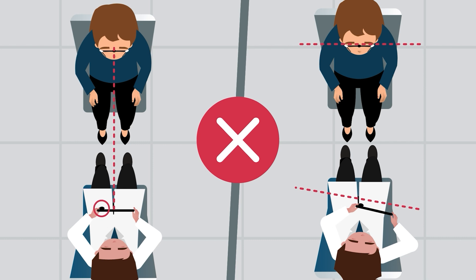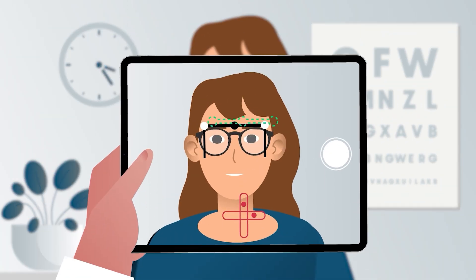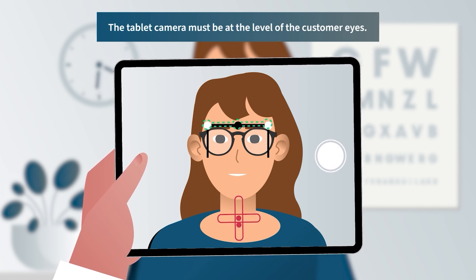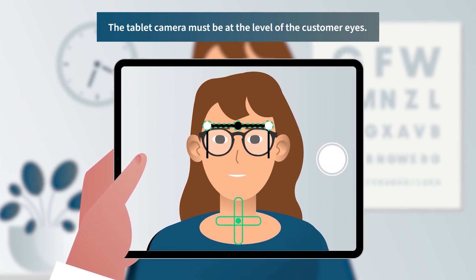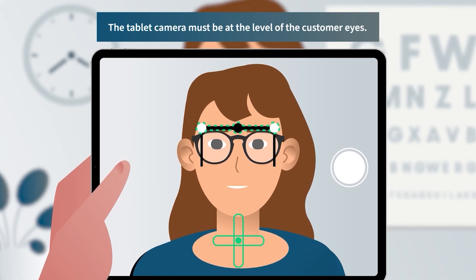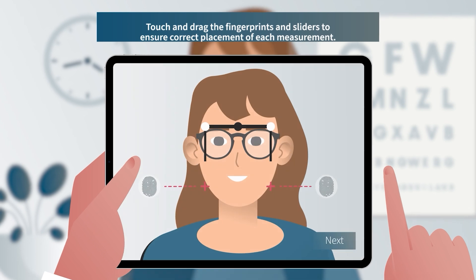These are the most common mistakes when taking the photo. The reference frame should be inside the dotted green outline and the two circles inside the cross should merge into a single green dot. Turn the tablet if necessary. This is important to make sure the tablet is perfectly parallel to the reference frame.